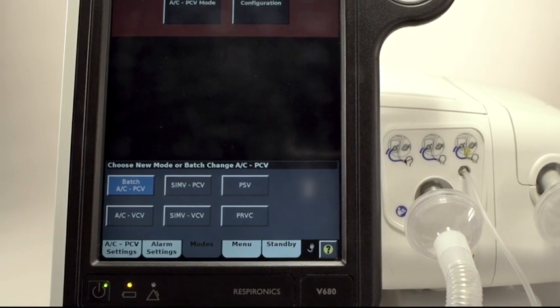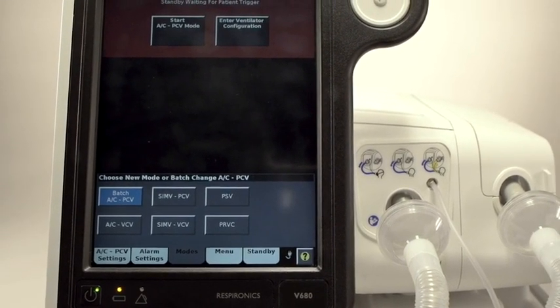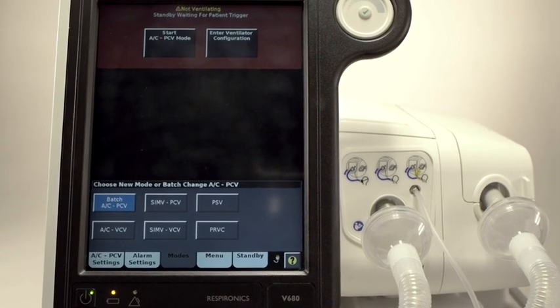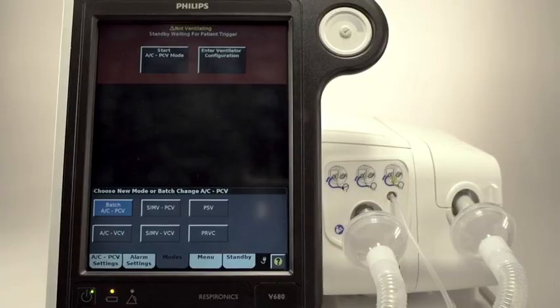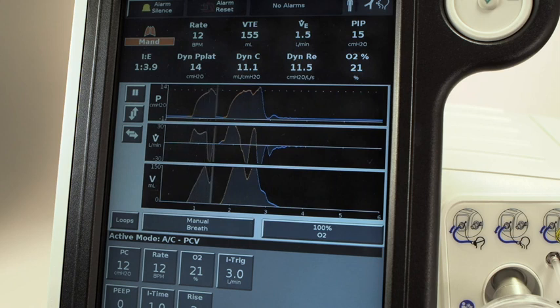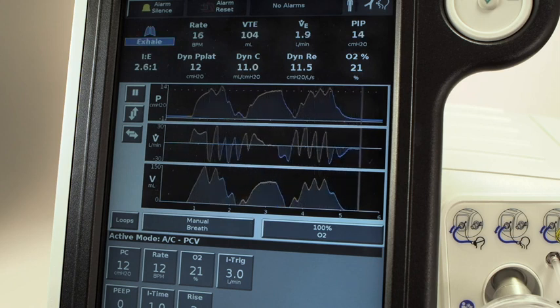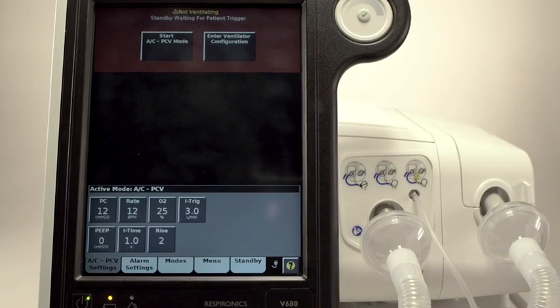Our transformation is complete. We have changed V680 from a single-limb, dedicated non-invasive ventilator into a dual-limb, invasive critical care ventilator. With this change, we have also incorporated the active exhalation valve in Pressure Control Ventilation. This will help to control exhaled gas pressure spikes to improve patient-ventilator synchrony.